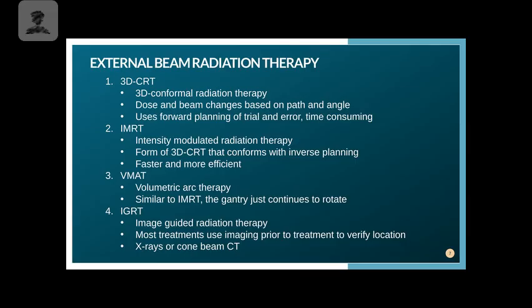We have IGRT, which is called image guided radiation therapy. And so 3D CRT, IMRT, and VMAT can all fall under the IGRT. What this means is that we are imaging every single day, or most days, to determine the location of our structures and align them so that they're as close as possible to the day before.